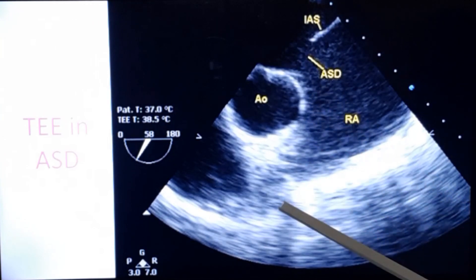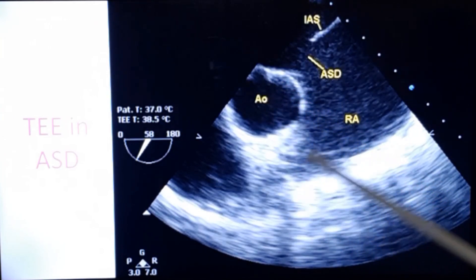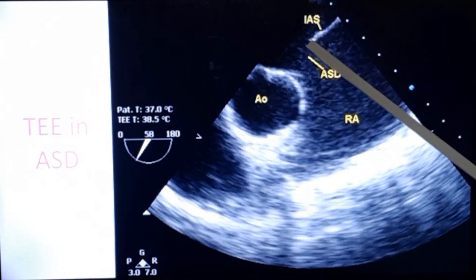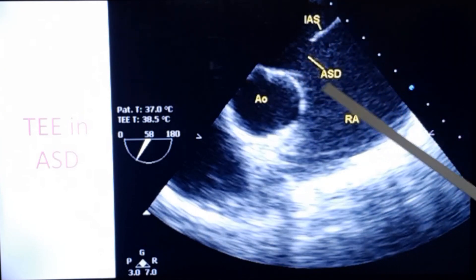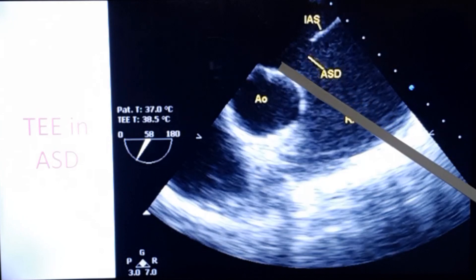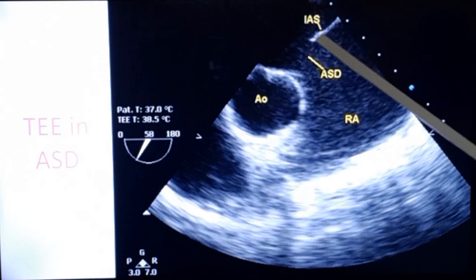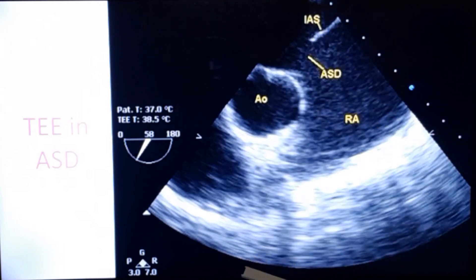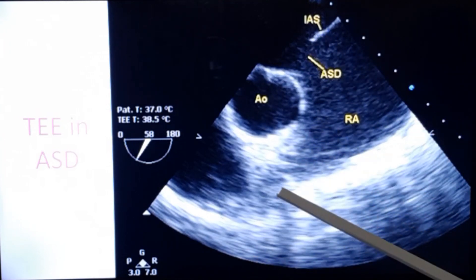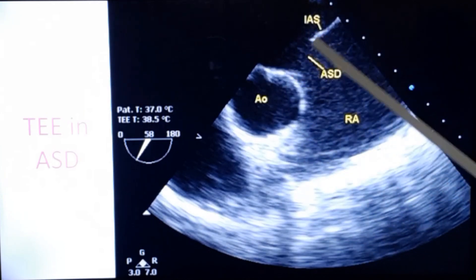This is the transesophageal echocardiogram. You can see the aorta here, inter-atrial septum, atrial septal defect, and right atrium. You can see that the aortic rim is deficient here — hardly any aortic rim for the inter-atrial septum defect. This is transesophageal echocardiography showing a single ASD.